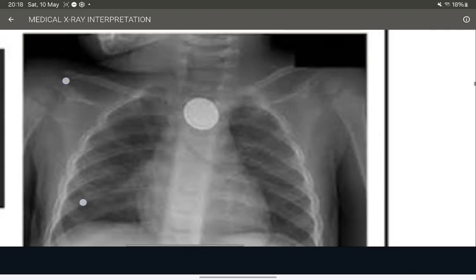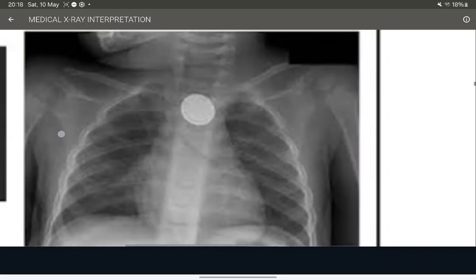You are the doctor covering a clinic. A mother brought her child to you and said, oh doctor, my child had coughed suddenly, I don't know what happened. Then you request a chest X-ray for the patient. You find an image like this. Since the five densities that we have reviewed before, the first density is air, which is black. Second is fat, like subcutaneous fat over here.